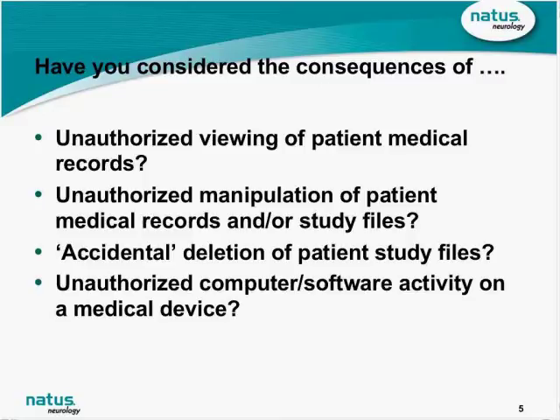For example, someone installs a game application or any other type of software program that has not been approved or tested by Natus. Consider the consequences of all of these. You could be paying a pretty high price if you're dealing with any of these situations.